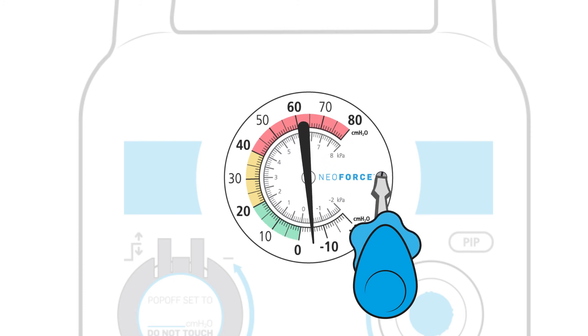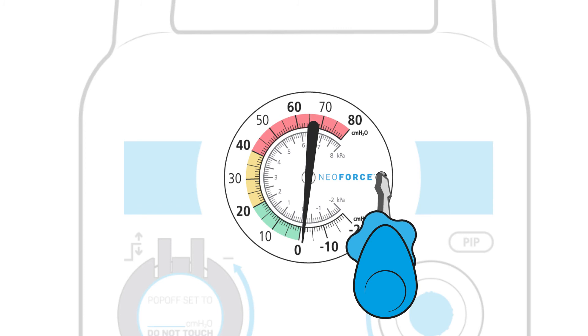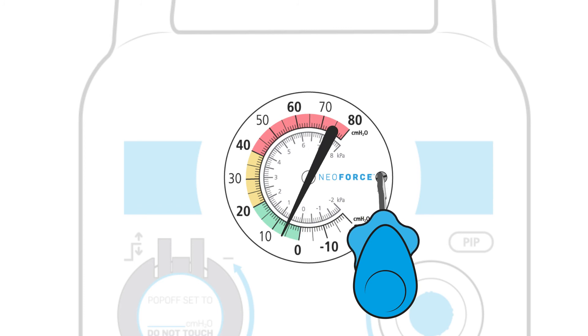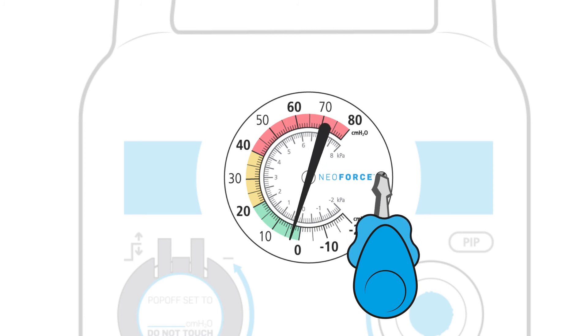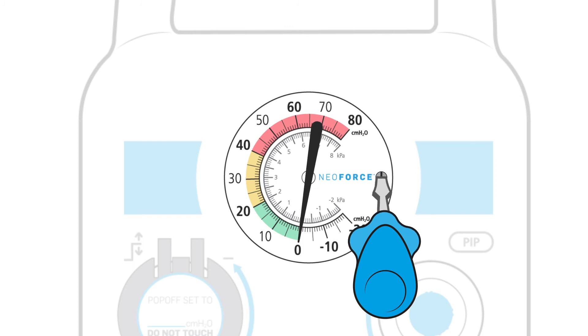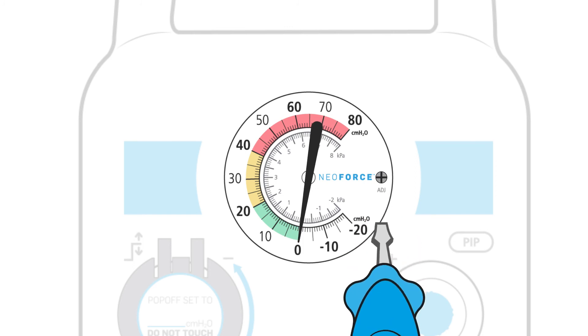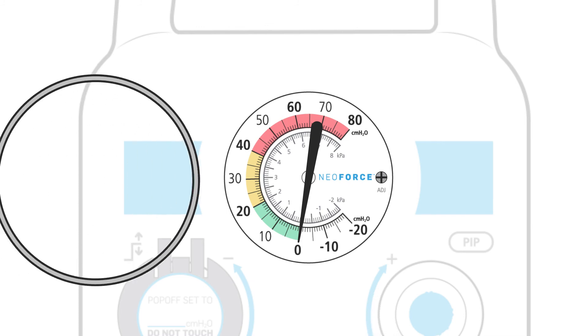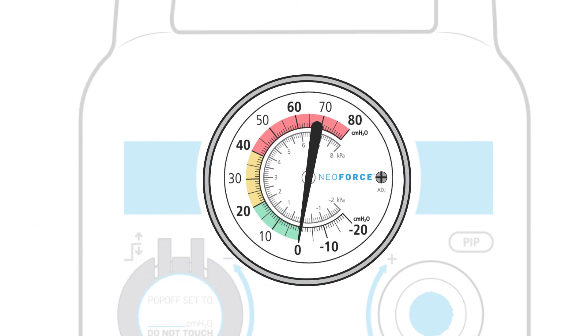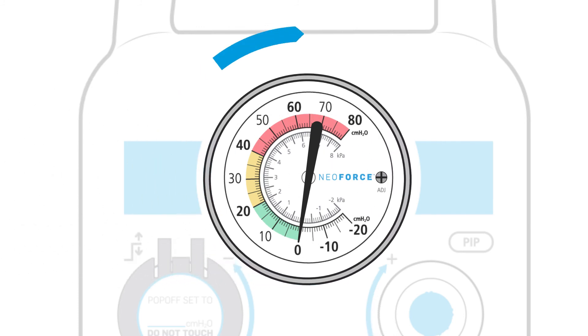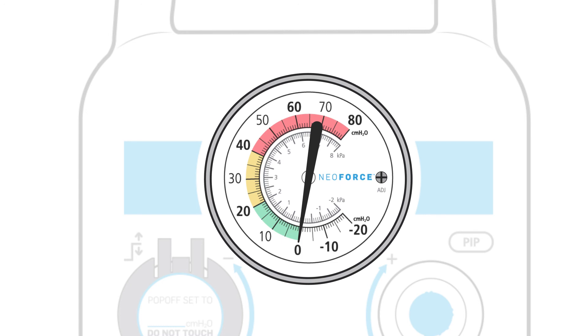Turn the screw clockwise if the needle reads below zero centimeters of water. Turn counterclockwise when the needle reads above zero centimeters of water. Move the needle a few times to ensure that the needle returns to zero. Return the gauge cover to its place and lock by rotating one quarter turn clockwise.